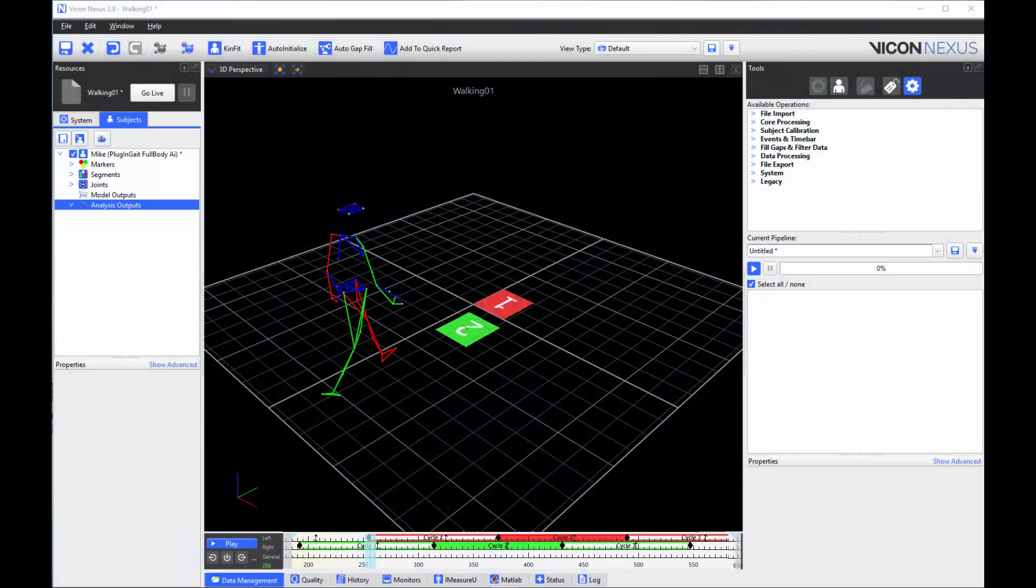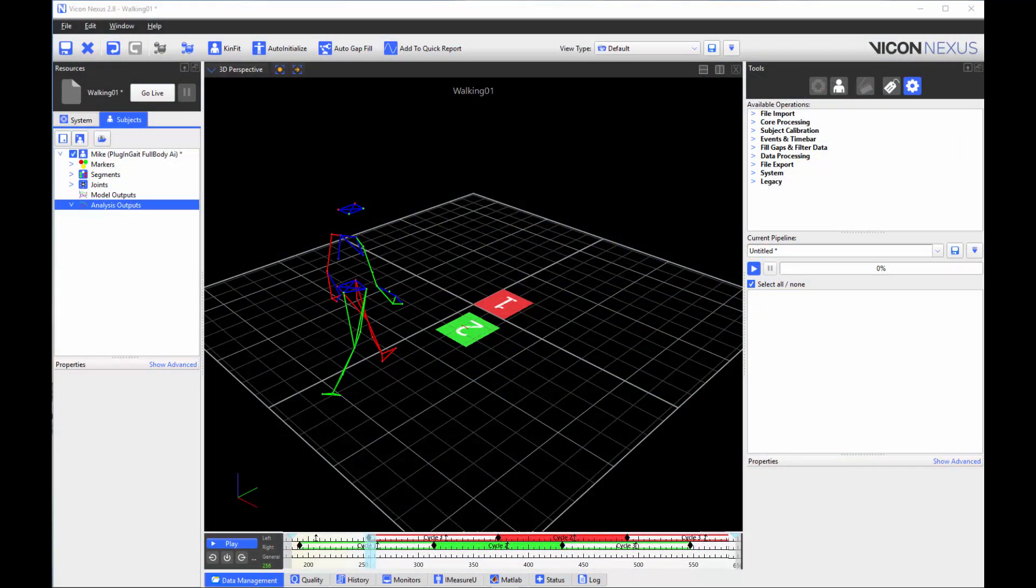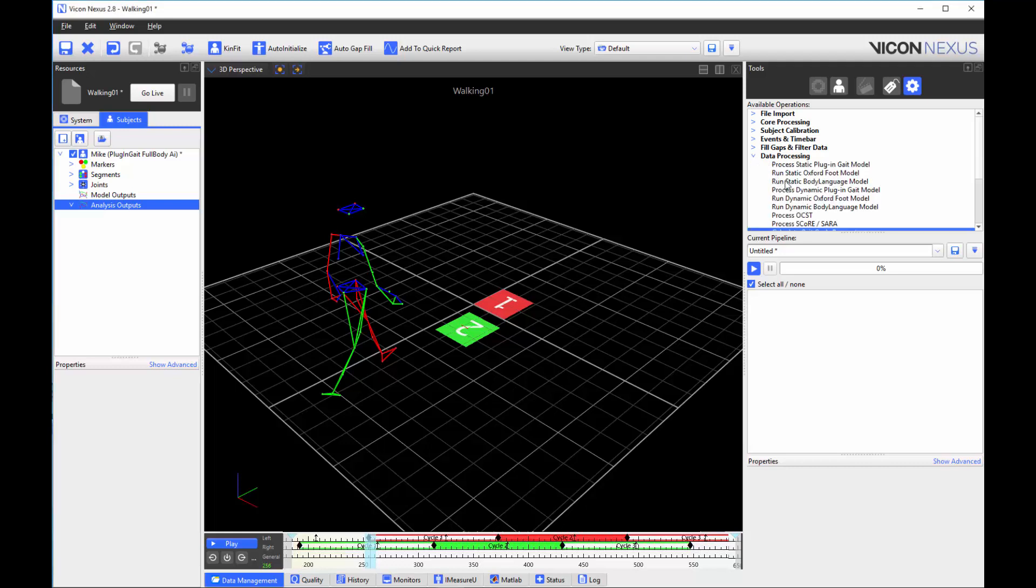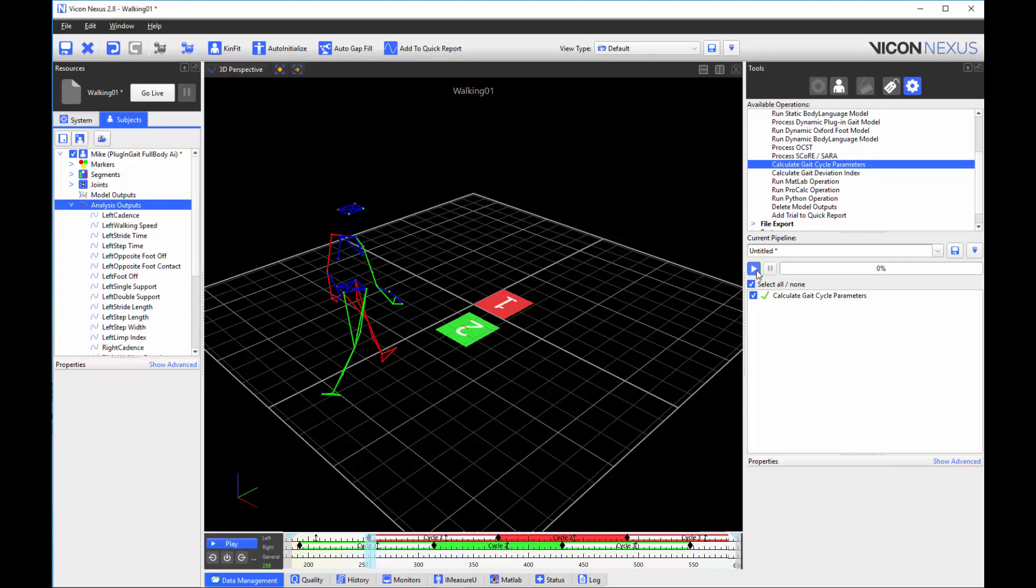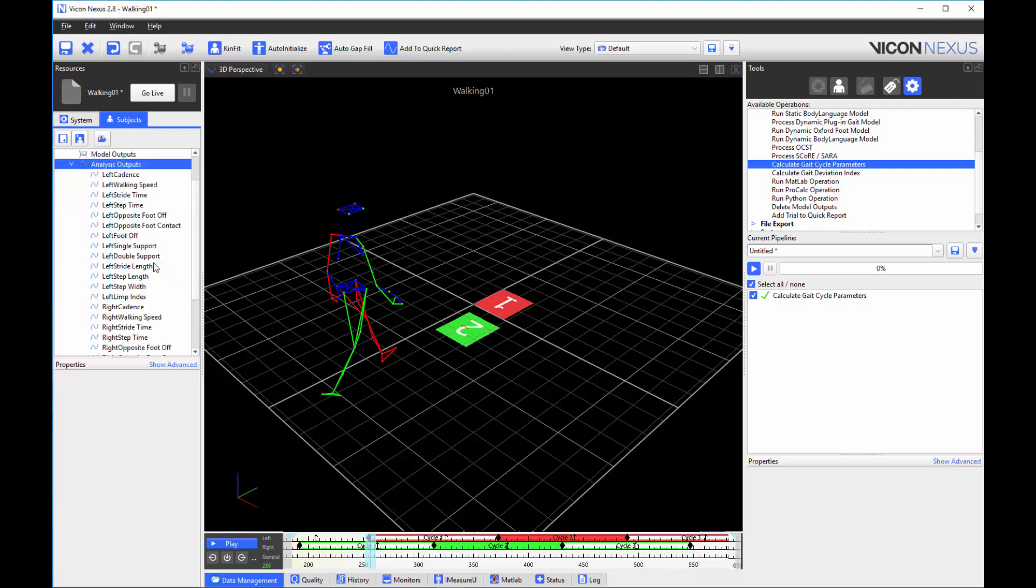The step width and limp index is now calculated as part of the gate cycle parameters. To run this operation, load a trial that includes a complete gate cycle. Add the gate cycle parameters operation to your pipeline and run. You can now see the step width and limp index in the analysis outputs.